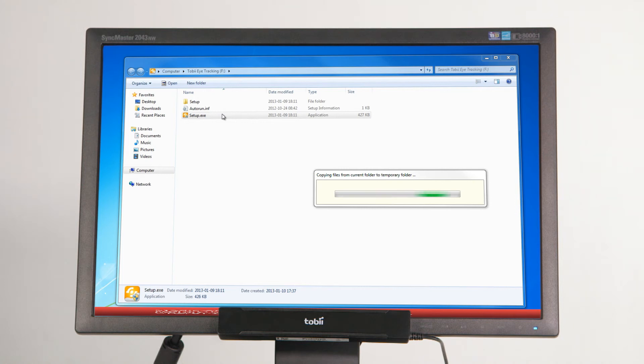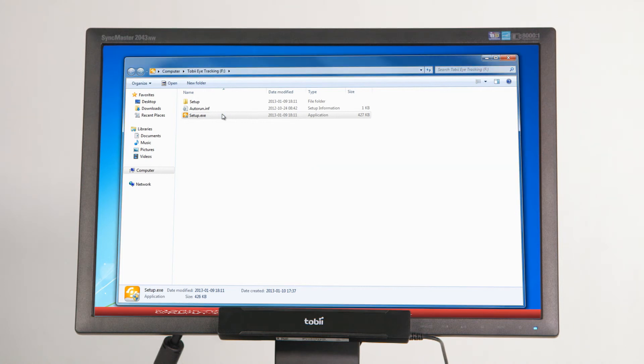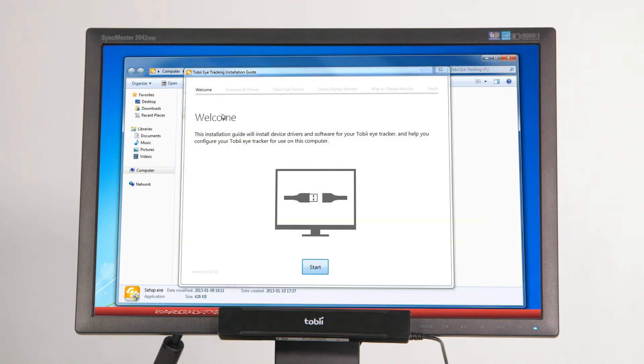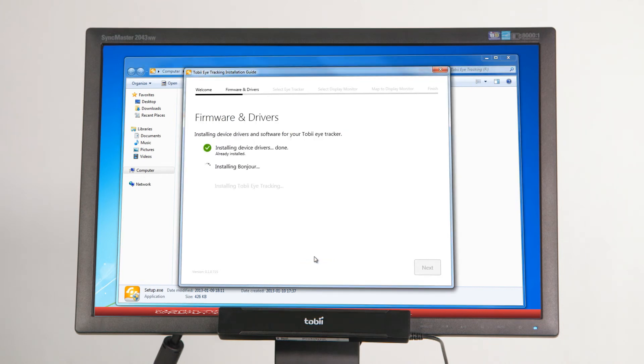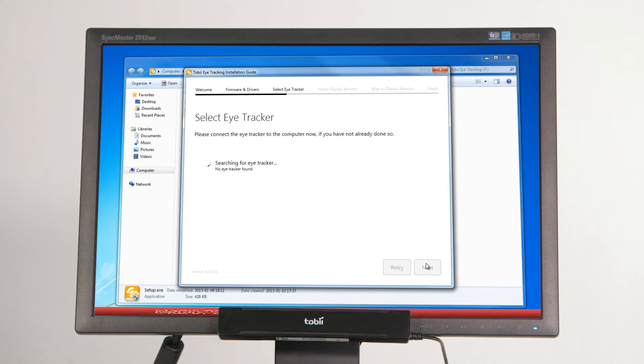The first two steps in the installation process will install the software necessary for using the Tobii X2 eye tracker. In the third step of the installation process, you'll be asked to connect your Tobii X2 eye tracker to the computer.